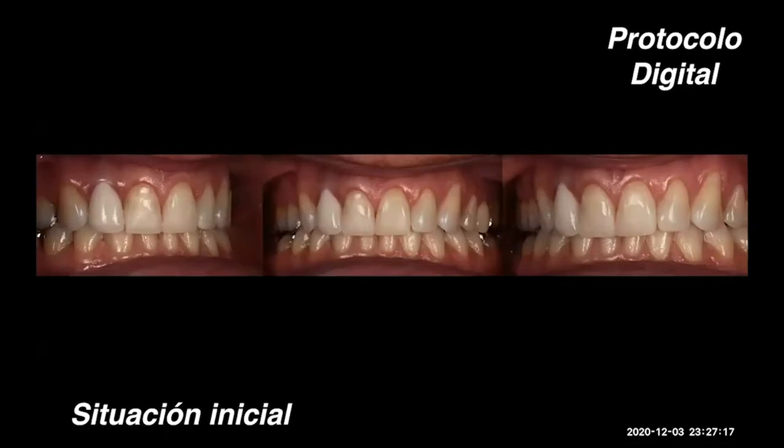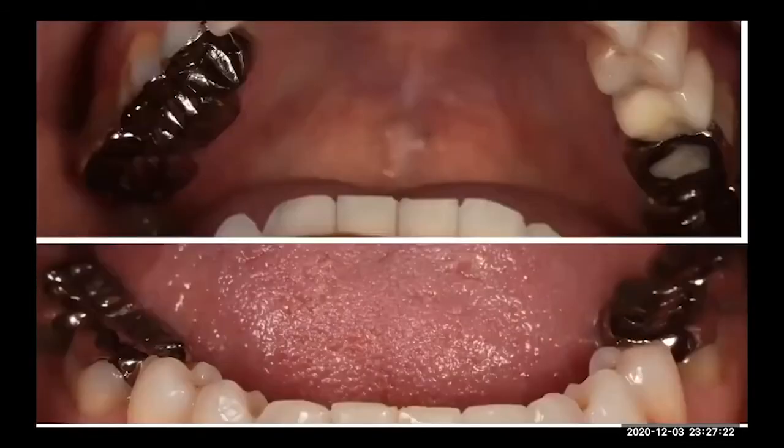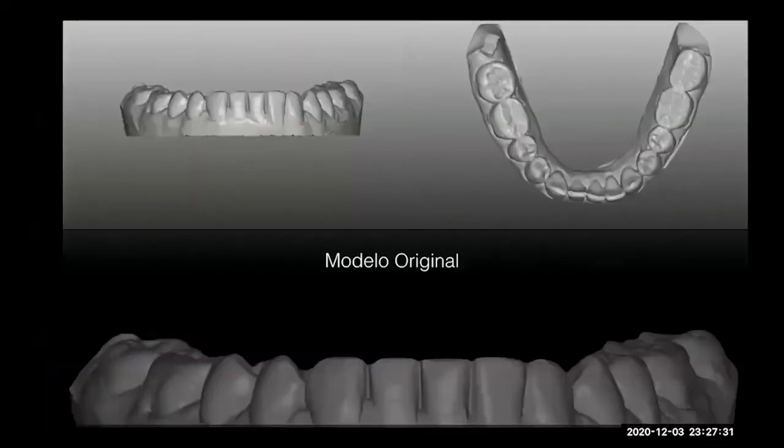and at the same time, everybody is closing vertical dimension. So what is the protocol here, or what is the treatment here? The treatment here is to remove the gold restorations and try to compensate a little bit the curve of Spee. So we start doing something in the posteriors, in the lower posteriors.